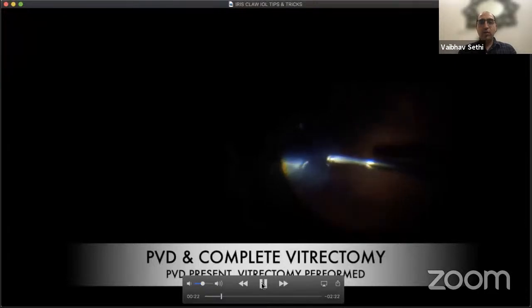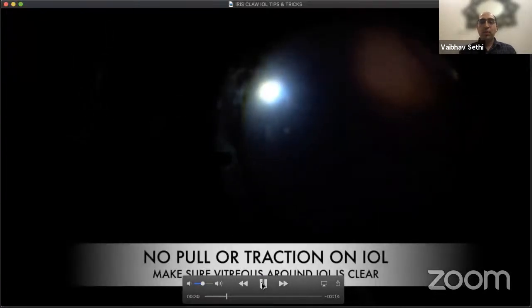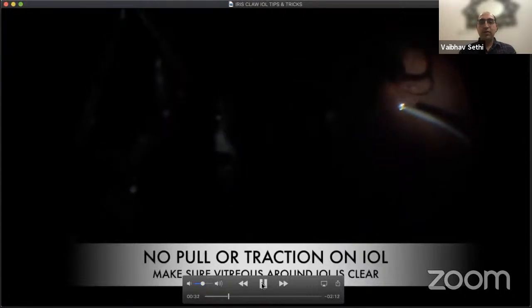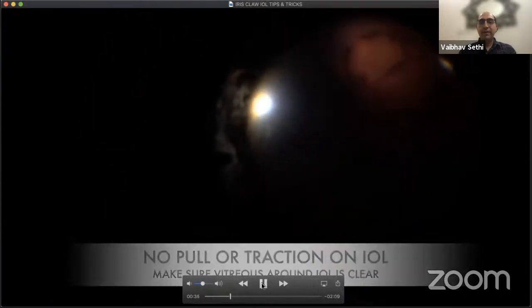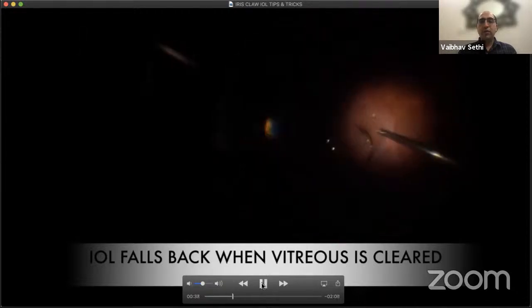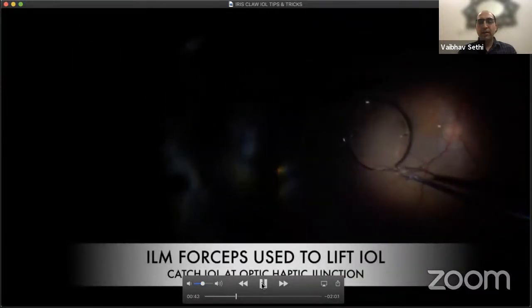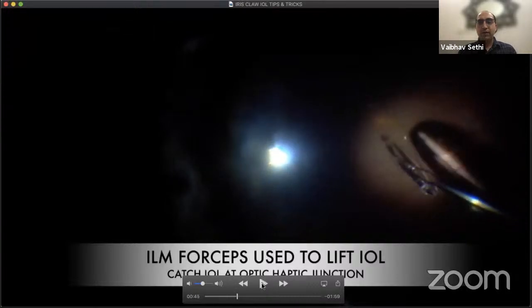I normally do a PVD, because it really helps me make sure that I'm not pulling any vitreous when I'm picking up the IOL. So no pull or traction on the IOL is a must. Make sure there's no vitreous, and the telltale sign, especially if the IOL is a bit peripheral and one of the haptics is stuck to the periphery, you might tend to just pull on it and pick it up. Don't do that, because there is some vitreous there. The only way you're going to be sure is when the IOL falls back onto the posterior pole. So in my case, after I'm done with the PVD and there's no vitreous there, I'm sure about it.